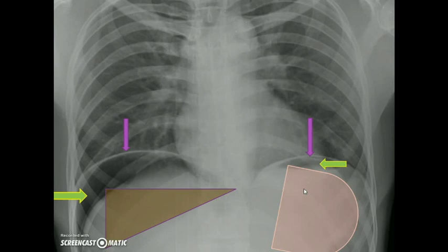An interesting fact: even though I started with abdominal X-ray erect, what we are actually looking at is a chest X-ray — chest X-ray PA view, erect view. Our inference is that even a chest X-ray can be very helpful in detecting pneumoperitoneum.